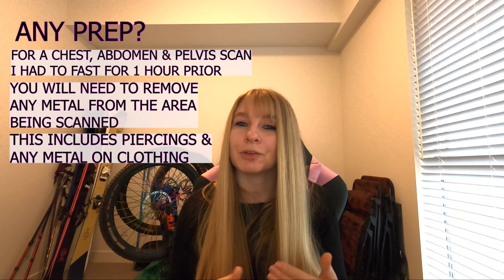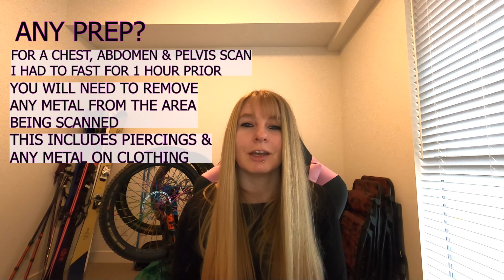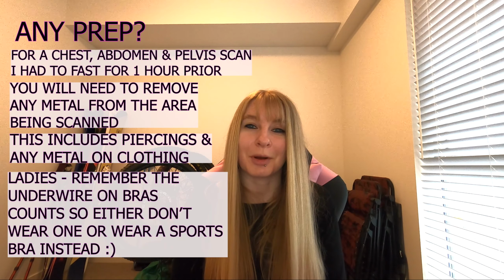So you should also think, if you've got piercings anywhere else, then to remove those if you're having this kind of area scanned. And ladies, if you're wearing a bra with underwire, that will also count. So either don't wear one or wear a sports bra.